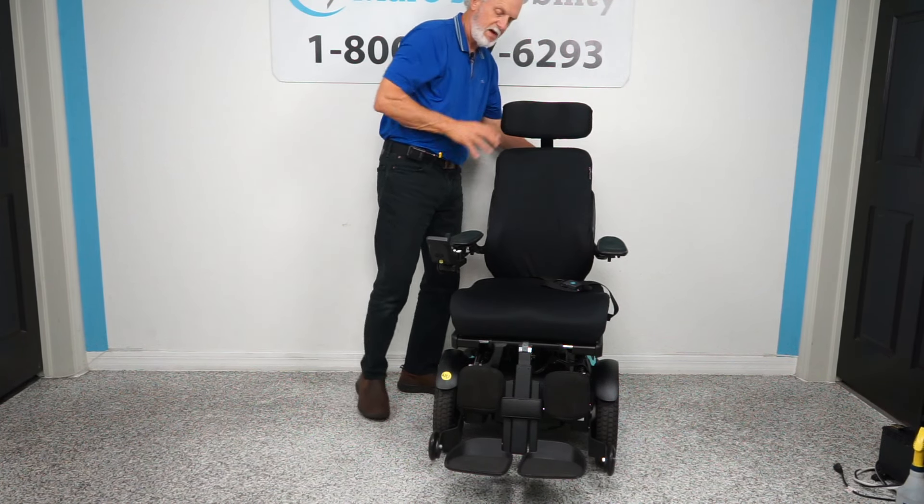This is the Permobil F3 — the Rolex of power chairs. It has a top speed of 6.2 miles per hour — it's like riding on air. When you let the joystick go, it stops automatically because of the built-in brakes in the motor. You can also use the joystick like a gas pedal — push it a little and you're barely moving, or reduce the speed through the settings.